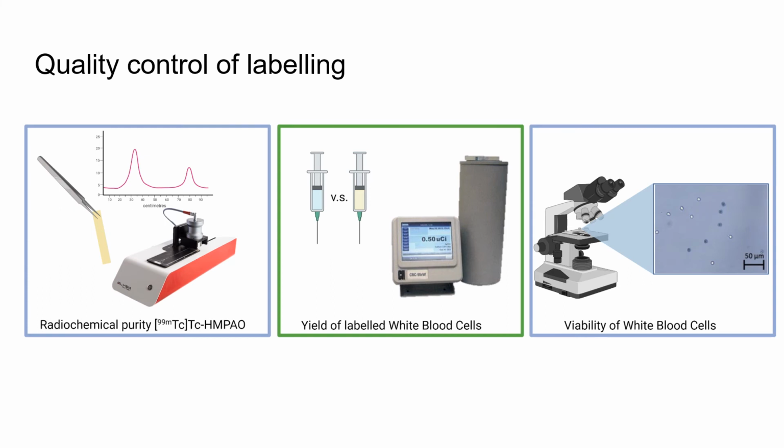There is a lot of quality control going on. You first of all have to check the radiochemical purity of technetium HMPAO. If you want to know more about that, let me know. This will probably be covered in another lecture.